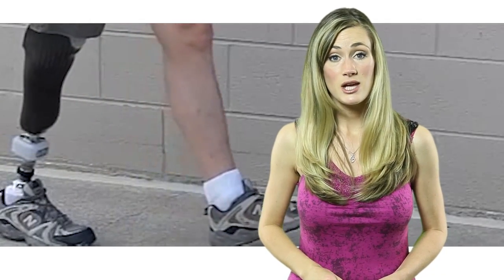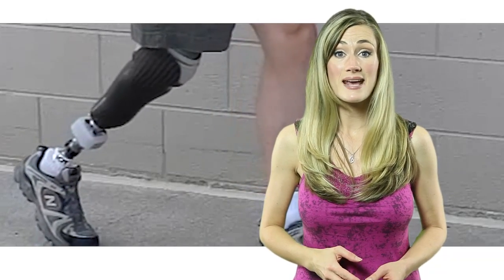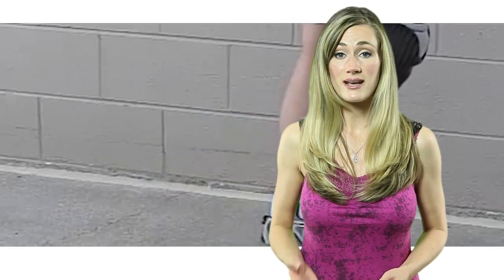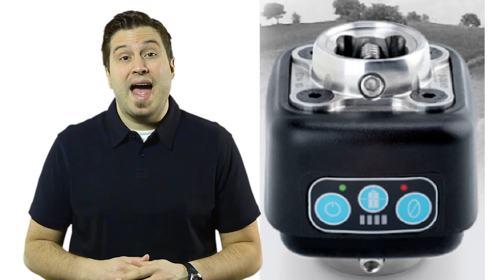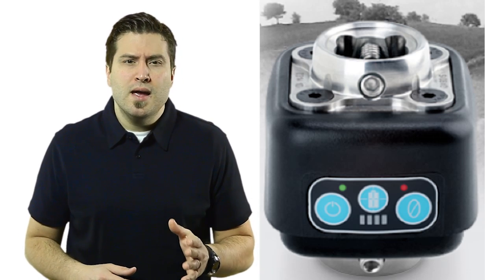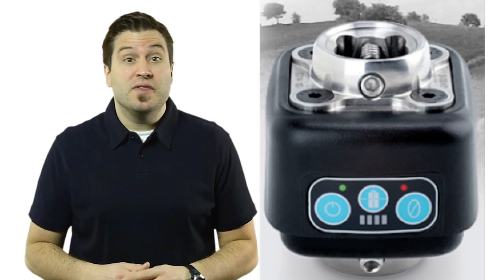The first step in achieving proper alignment is gathering data. So College Park Industries developed a unique wireless sensor and data logging module called the IPEX Lab. The IPEX Lab is mounted between the prosthetic leg and the residual limb. Using internal strain gauges, the IPEX Lab measures the forces and moments on all three axes. If a force or moment is above a specific threshold while the person is walking, the alignment of the prosthesis can be adjusted in order to improve the gait.